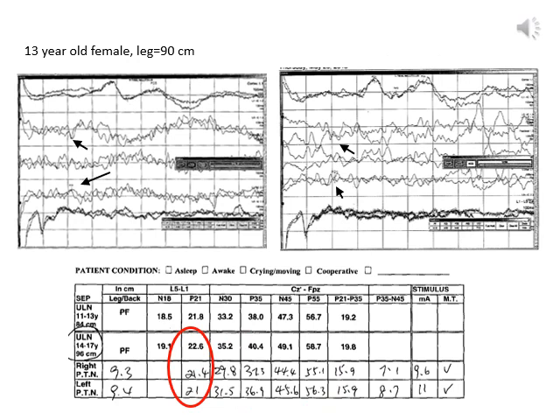The lumbar responses are a little difficult to identify here, as they often are, because they're quite small and the recordings can be quite noisy. But what we're looking for is a little phase reversal at around 20 milliseconds, which would be the P21. And so in this case, the arrows would mark what might be a phase reversal and possibly a P21 for both the right and left legs. And when we look at the latencies, they're within the upper limits of normal. And so with a little caution, we might call these the P21.